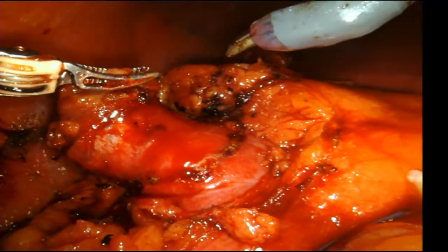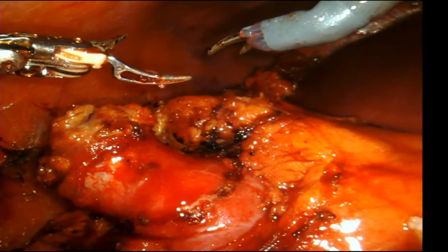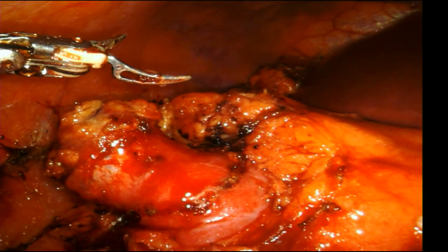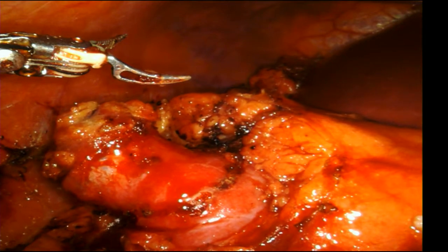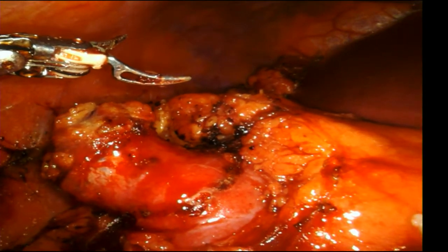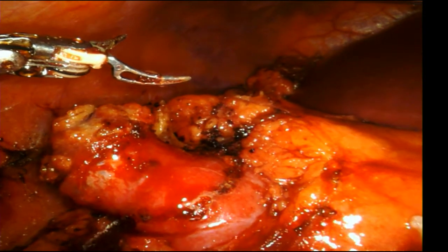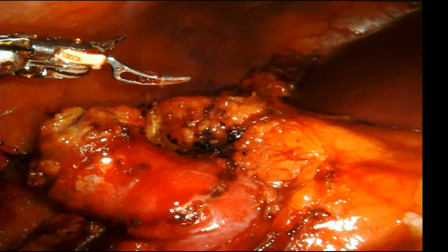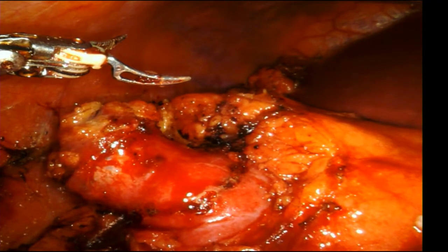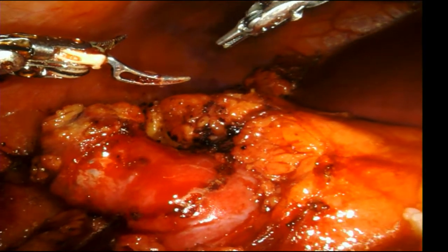All right, let me have the Vloc now, and let's test the needle drivers. Part of our checklist is to test the needle drivers, because the last thing in the world you want to happen when you're on clamp is to have an expired needle driver. So we always test the two needle drivers, make sure they both have lives. I like to put the needles, the Vloc, or the deep suturing inside the body. And I usually on the right side will put them on the liver. And then the capsular reconstruction sutures we'll do after we come off clamp, so we don't need those ready to go.